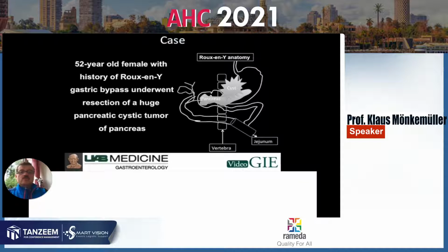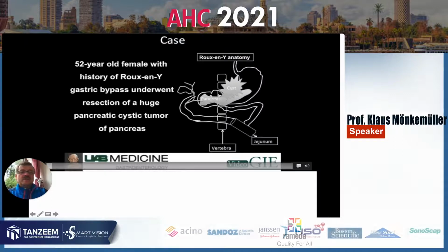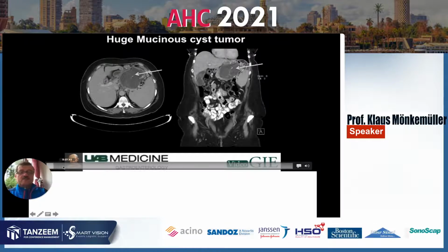And lastly, here we show you a case of a patient who had a resection of a pancreatic cystic lesion in the presence of gastric bypass.